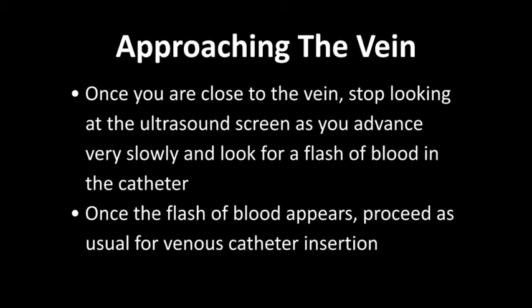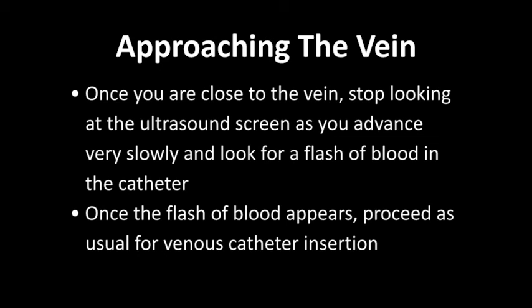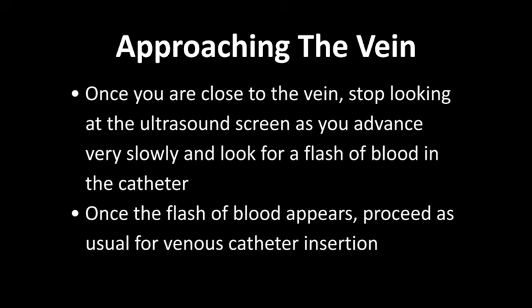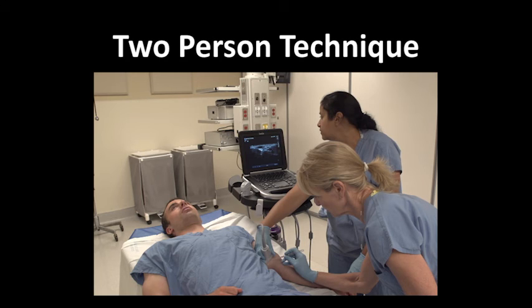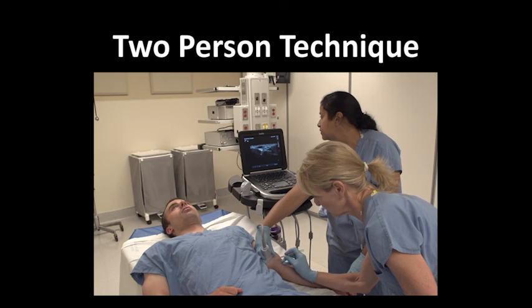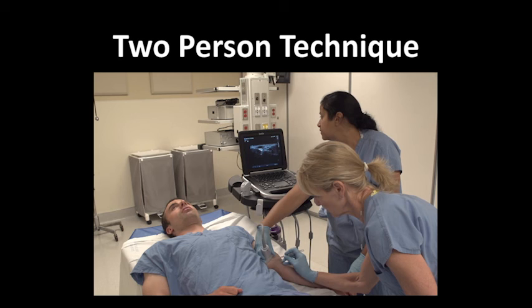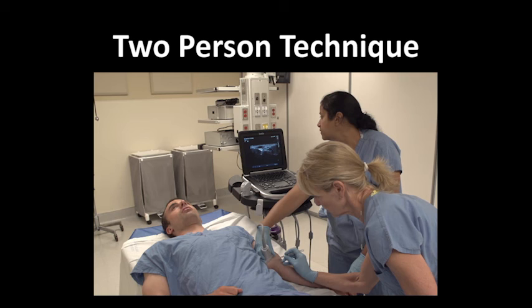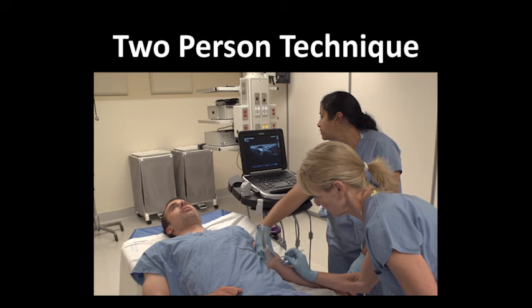Once you are close to the vein, stop looking at the ultrasound screen and turn your attention to the catheter. Advance very slowly and look for a flash of blood in the catheter reservoir. Once the flash of blood appears, proceed as usual for venous catheter insertion. Some practitioners prefer a two-person technique, where the ultrasound operator looks at the screen, holds the probe, and uses verbal cues to direct the catheter operator, who is looking only at the catheter and patient.